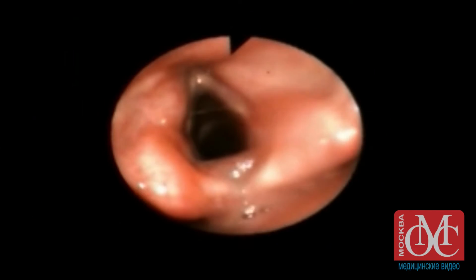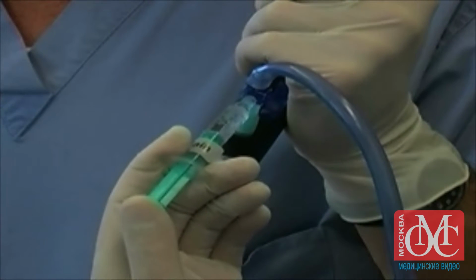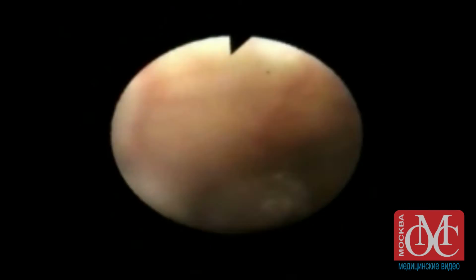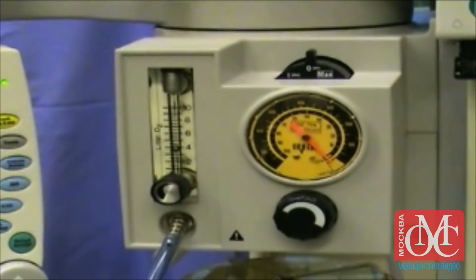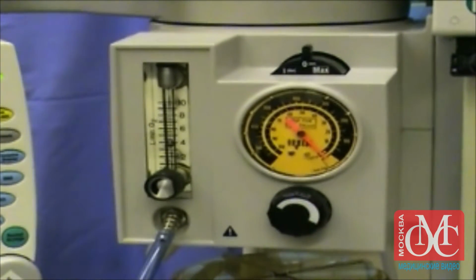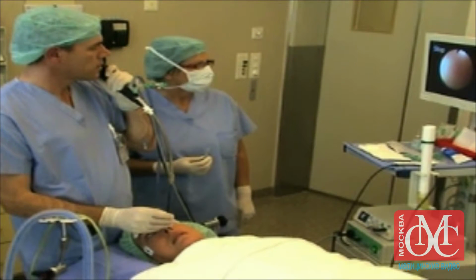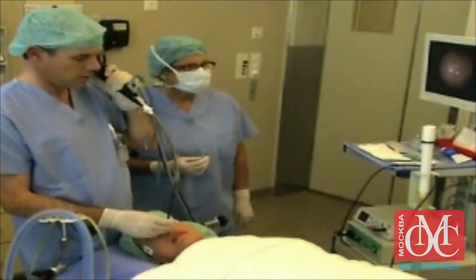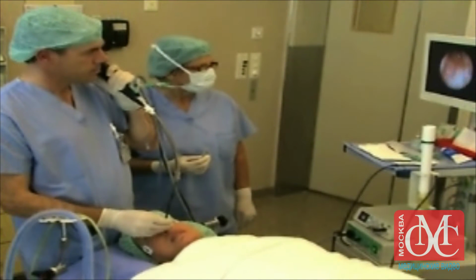At the supraglottic region, introduce 1 to 2 milliliters of local anesthetic through the working channel of the fiberscope while administering oxygen to propel the anesthetic into the area. Advance the fiberscope posterior to the epiglottis and through the vocal cords, taking care to avoid any direct contact with the pharyngeal and laryngeal structures. You can facilitate the advancement through the glottis by making a slight downward movement with the tip of the fiberscope.